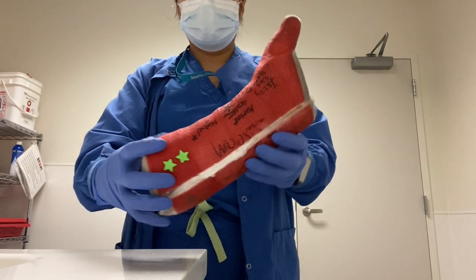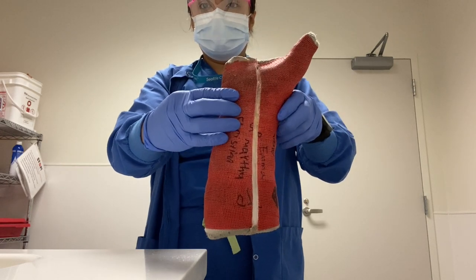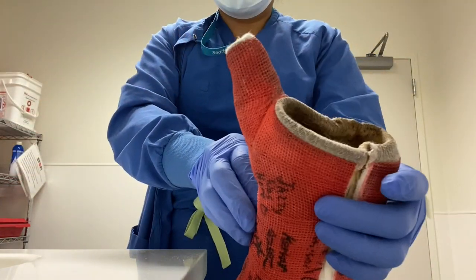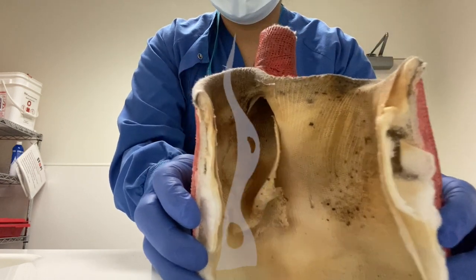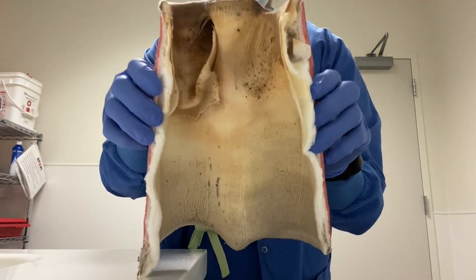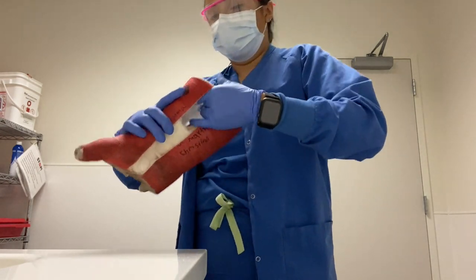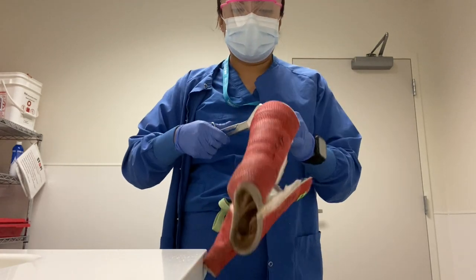This is one of the dirtiest thumb spica casts I have ever seen. When I opened it up and took it off the patient, it was just so dirty by the thumb piece and very stinky. The craziest part is that this patient wanted to keep the cast, so I had to remove all the padding and give it back. I know that once the patient gets home they're going to toss this cast away because it is just very stinky — if you are a parent, you probably don't want this cast to stink up your whole house.